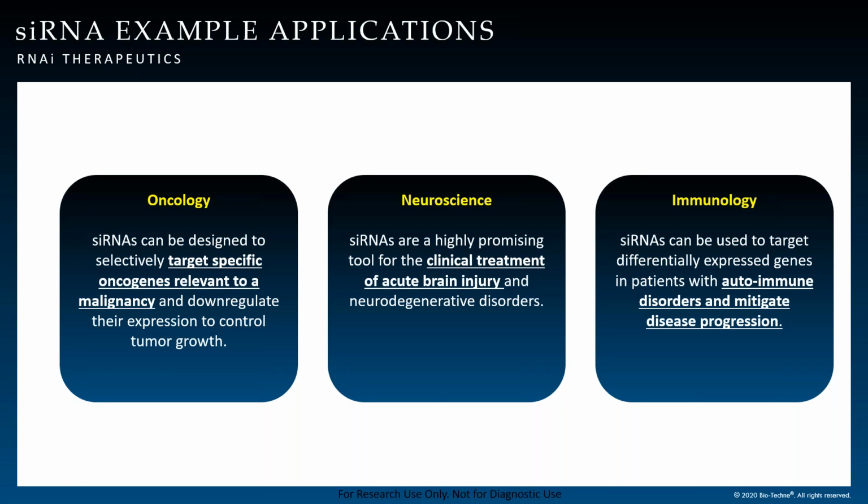Next, another application that we'll be discussing is siRNA detection, or small interfering RNAs. These small RNAs have shown very significant potential in 3 key areas, which include oncology, neuroscience, and immunology. In terms of oncology, these siRNAs have been shown to be a great therapeutic agent, targeting key oncogenes, and in this way downregulating key signaling networks in different cancer or tumor growth.